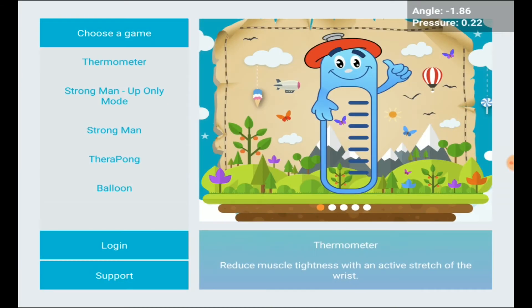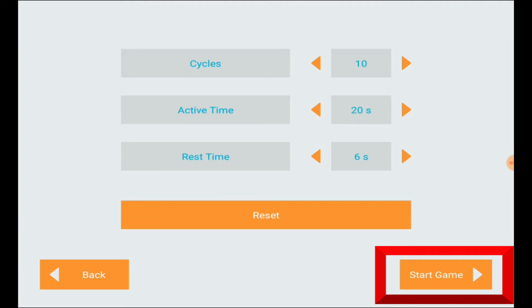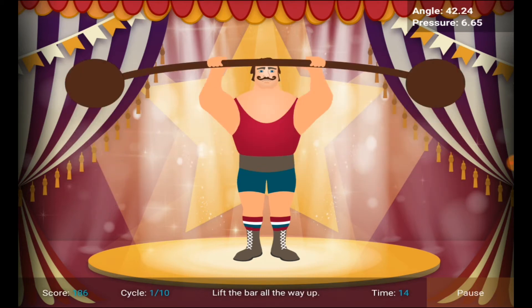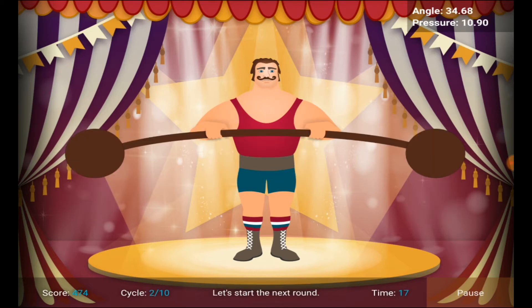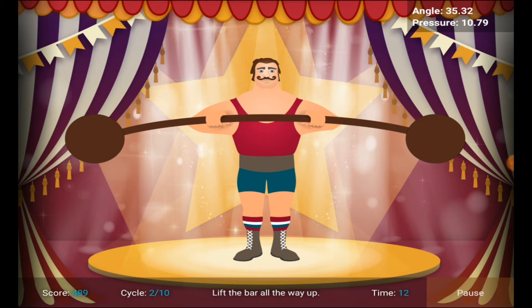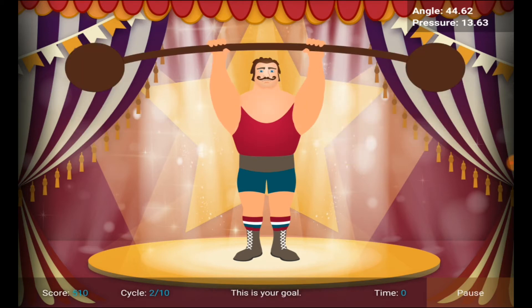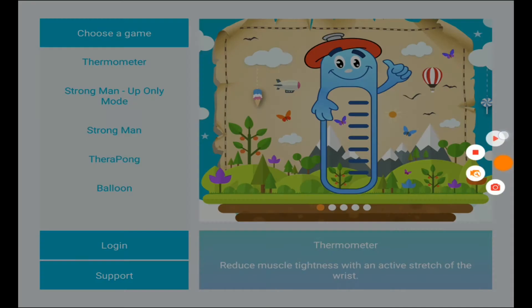The second game is the Strongman Up game. Select it from the game selection menu, then hit next and start game on the bottom right. Lift your hand up and as you do, the strongman will raise the barbell above his head. When you reach your goal, you'll see 'excellent' and have a few seconds of pause. If you're having difficulty reaching the goal, the device will assist you and give you a small 30-second stretch before resuming the next cycle.